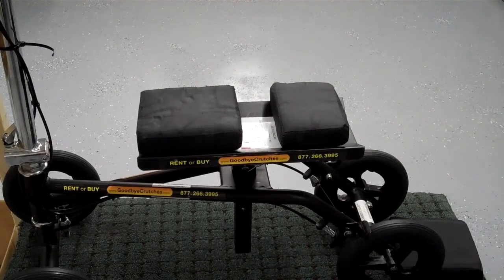This is an instructional video on how to change the knee pads for a Pathfinder turning leg caddy. The video will take longer than it actually takes to do — budget about 30 seconds to change these pads.